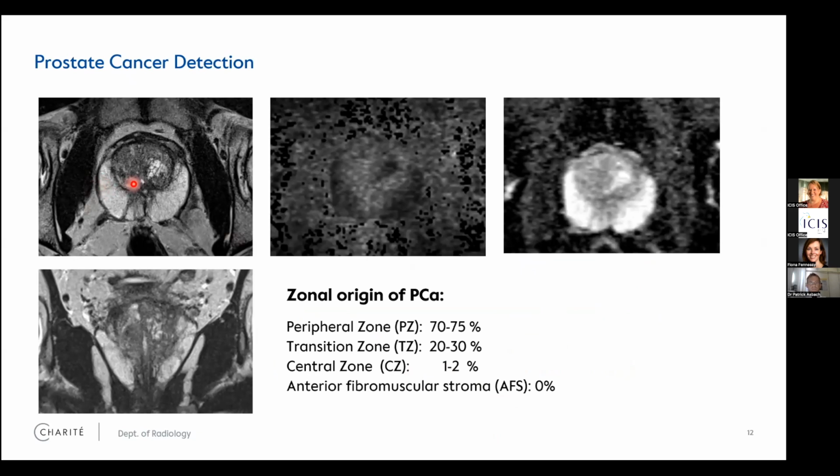This is a normal prostate MRI scan. On the upper left, you see an axial T2-weighted image. This is a coronal T2-weighted image. This is the high b-value image from the diffusion, and this is the ADC map. You see this enlargement of the transition zone. You nicely delineate the peripheral zone. We have some linear T2 hypointensities, which we find in many, many cases.